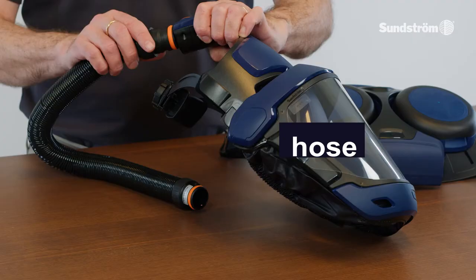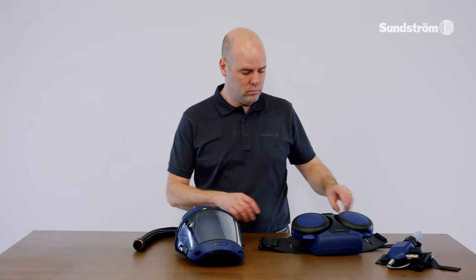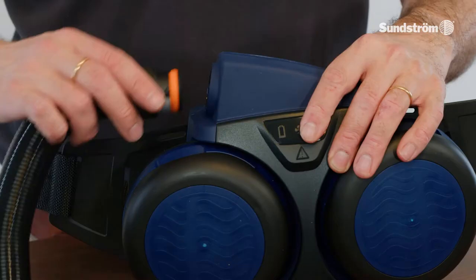Connect the breathing hose to the face shield. Connect the hose from the face shield to the fan unit or the compressed air attachment.